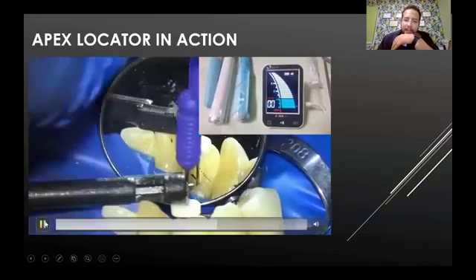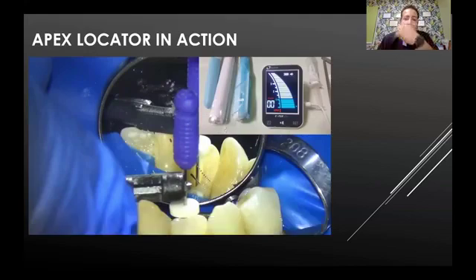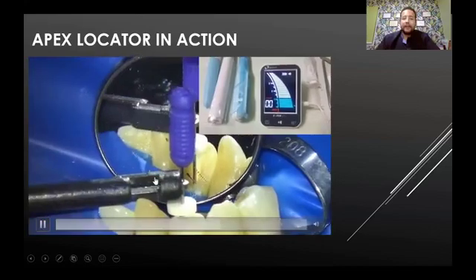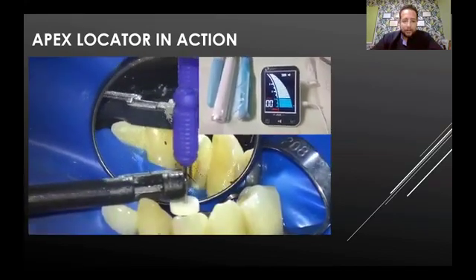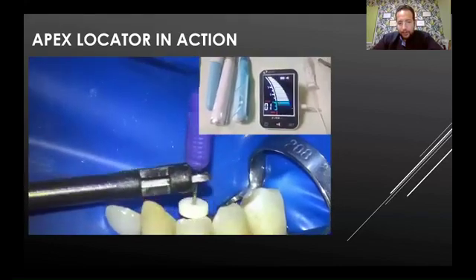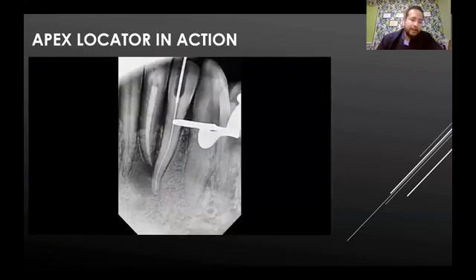Now, as I said, this is one of my first videos in using apex. You should go beyond apex and then come back to 0.0 point, and then take your X-ray. As I said, adjust your rubber stopper as your reference point. Then take your X-ray.